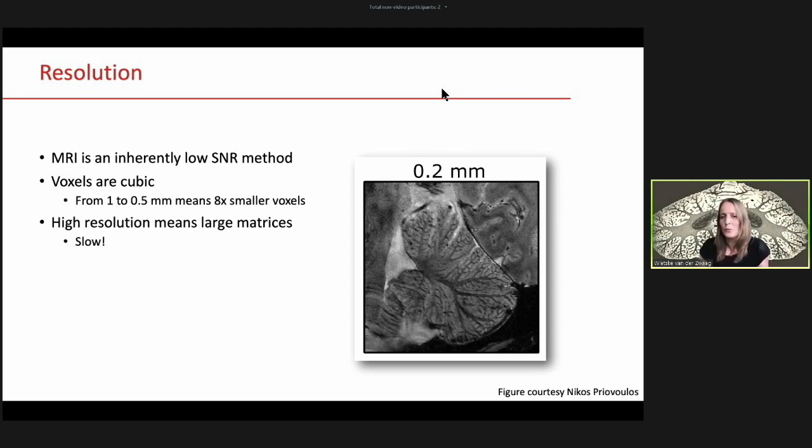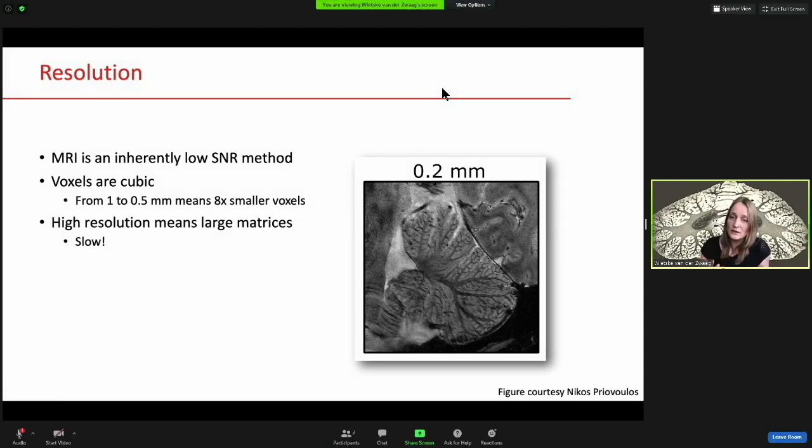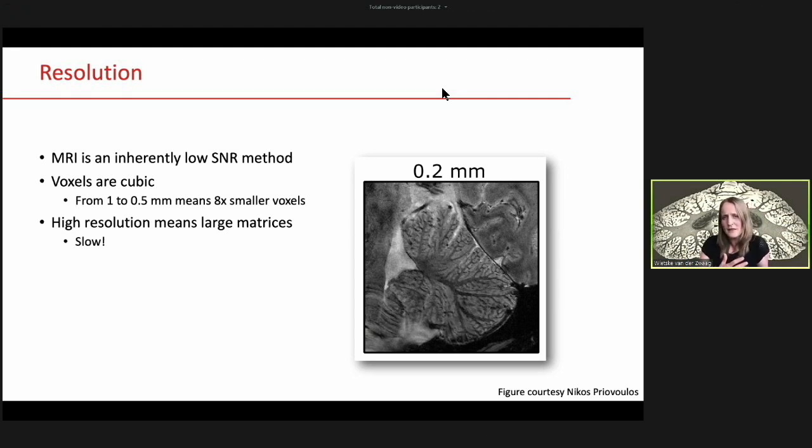And now we might be able to see the gray matter layer everywhere if we would have enough signal to noise. There are big patches here and around here, and even down here, something very strange is happening, where we simply don't have the signal power anymore to distinguish the tissue types. So it's a very thin line between having enough signal and then having enough spatial definition to be able to see what's going on. What you can also see is that this 0.2 is maybe not quite enough.